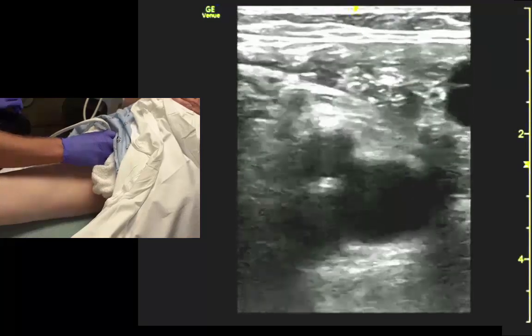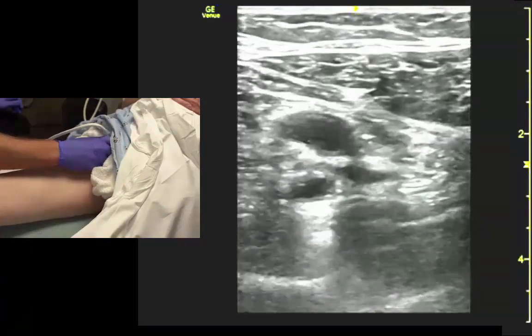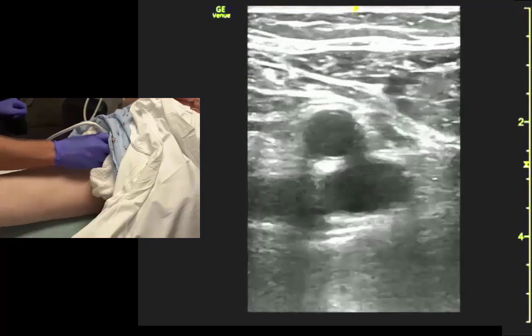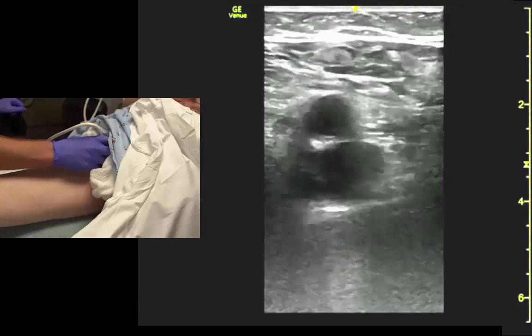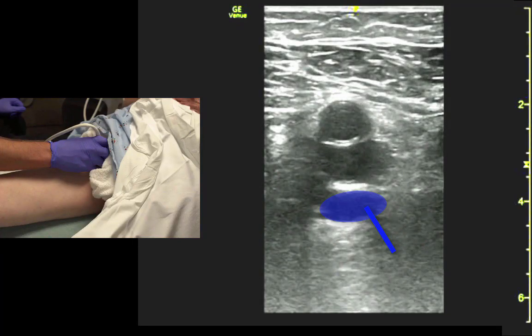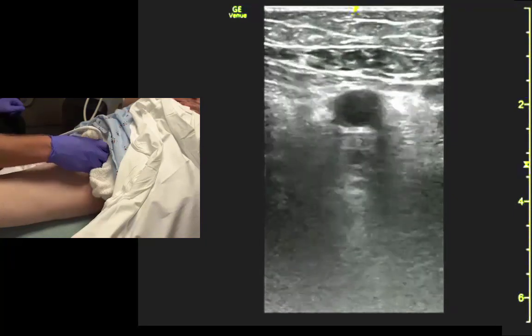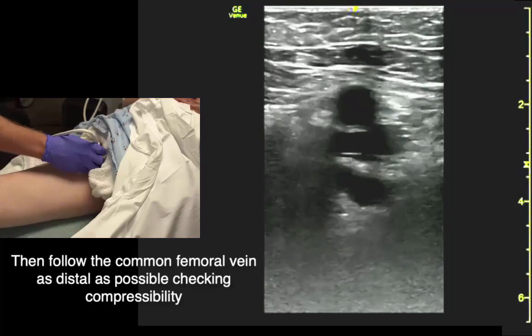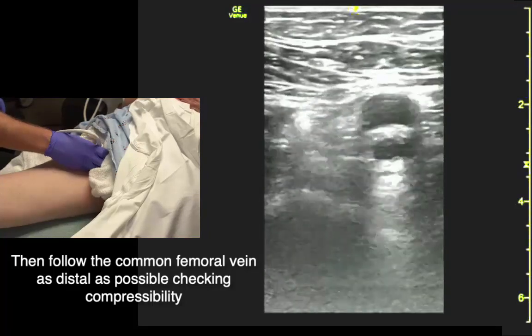The vein should collapse, and the artery resists compression. If we track the vein a little bit more distally, you can see they align themselves vertically. If we're careful, we can see the vertical split of the deep femoral vein — that's an important landmark when we're looking to rule out DVT. We need to make sure we see the deep femoral vein as well as the common femoral vein, and that they both collapse. You can see that deep one down there — up there they're together, there they split. If you're doing a DVT study, you've got to get down to that point.